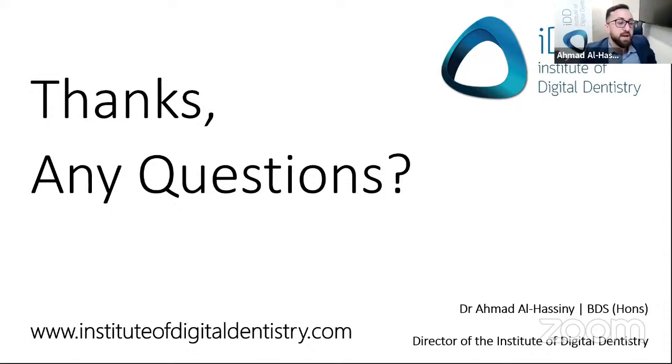Autofill feature, Adam, great point. I don't use the autofill feature at all. Don't rely on that, guys. The autofill feature is a feature on the Medit that if you have a gap, the AI will fill it in. Logic says that the AI may get it wrong. It's just connecting 2 points together and filling it in. So make sure if there's any gaps in key areas like the contact, like the prep, you need to go back and scan that. Don't rely on an autofill feature.